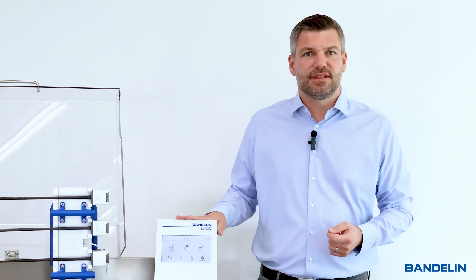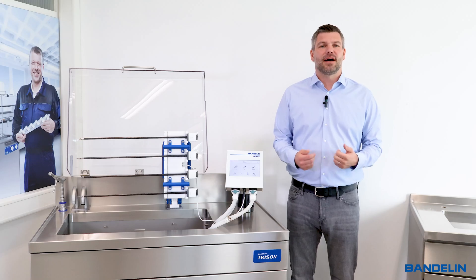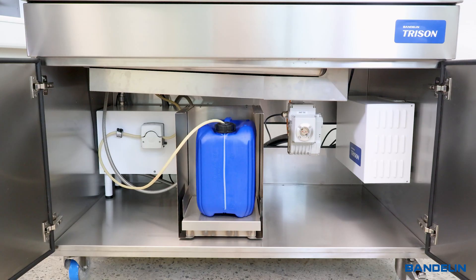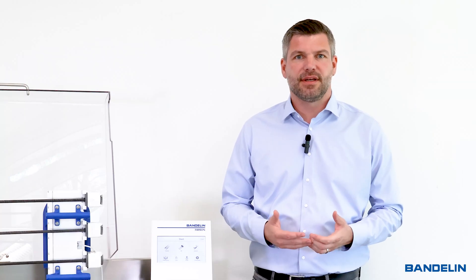No additional operating unit is required. The dosing unit is low maintenance and the canister can be changed in just a few simple steps. With the new accessories, the proven TRISON system is now even more user-friendly, time-saving and safe. More Than Clean — Bandelin.